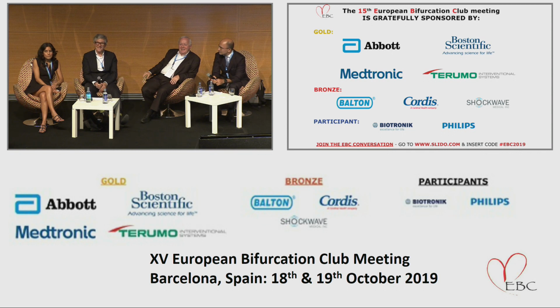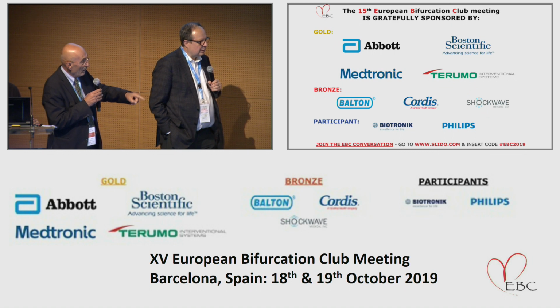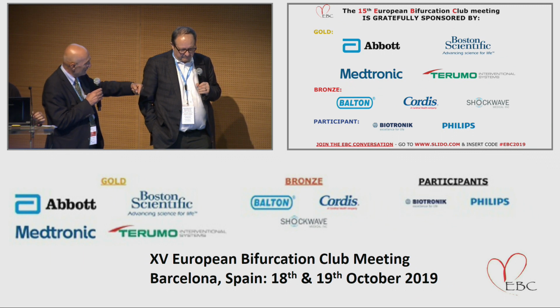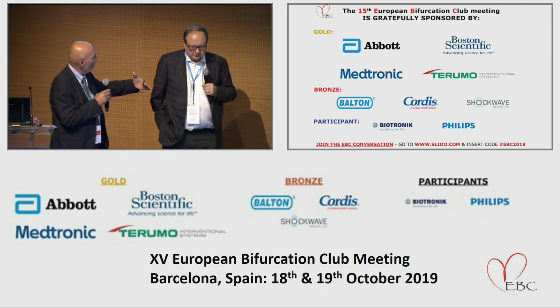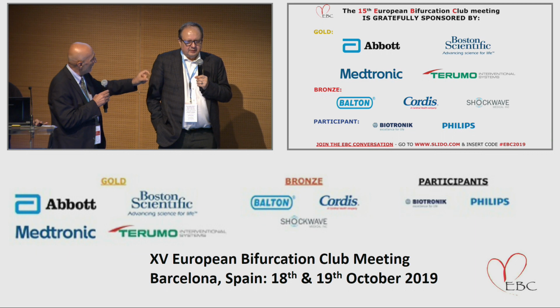Well, I think that kissing balloon will give you the possibility to fully expand the stent, without deformation after putting the second stent. That is preparation of the main vessel to receive the stent without any pushing on the crushed stent. And you are saying that crossing after putting the second stent distally, you take the risk anyway to cross behind the stent, because sometimes when you are crushing, if it is not fully apposed, you still have some gap at the opposite side of the side branch.